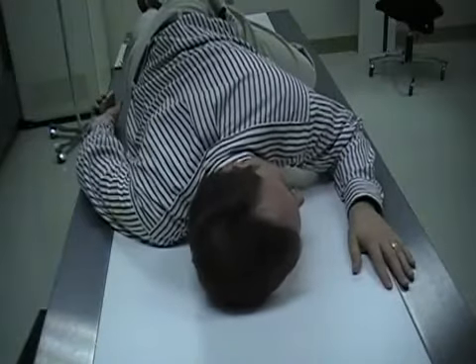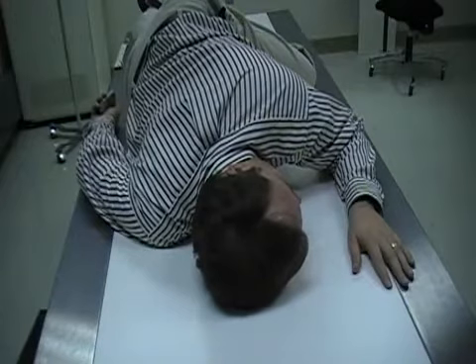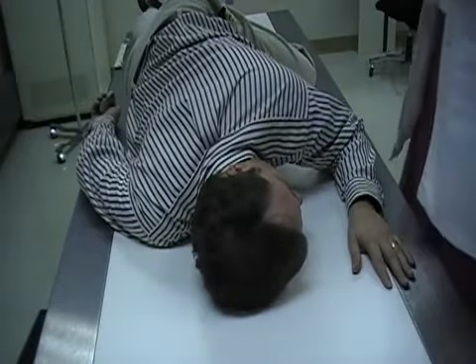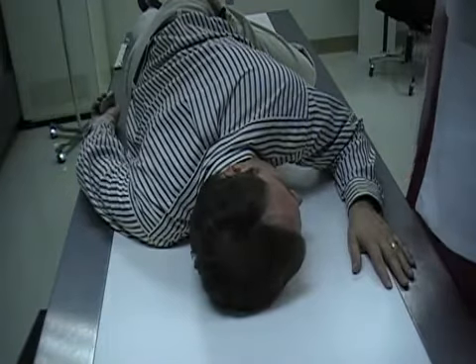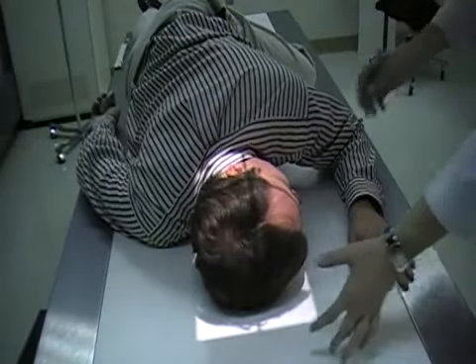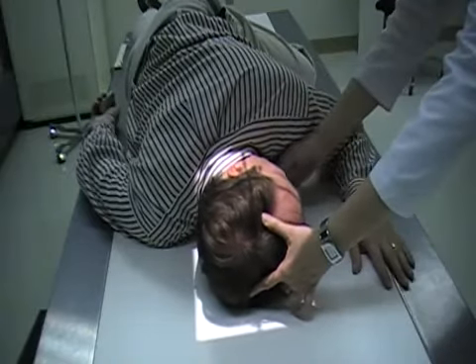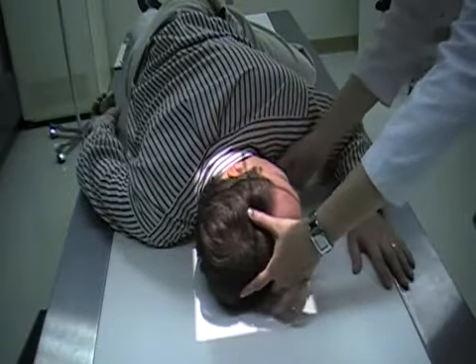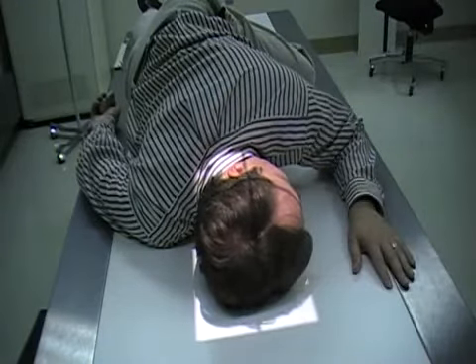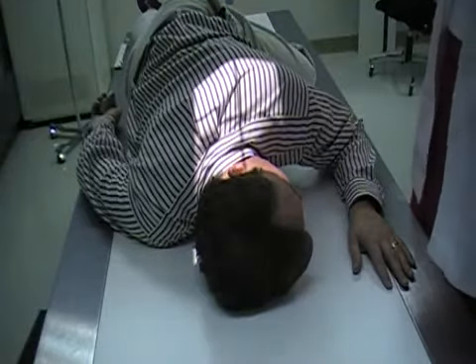We're going to do imaging on the mastoids and we're going to start with the modified Laws position for the mastoid. First you want to start out with your head lateral — act like you're doing a lateral cranium. Check your IOML, make sure it's coming out straight at you, which would be parallel with your image receptor. Also you want to have a 15-degree caudal angle.